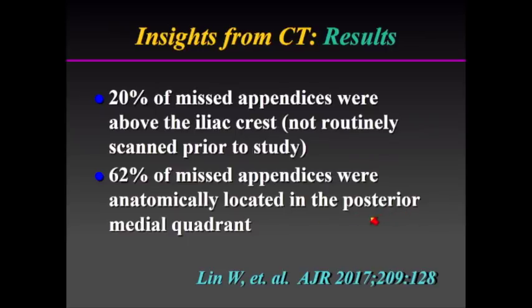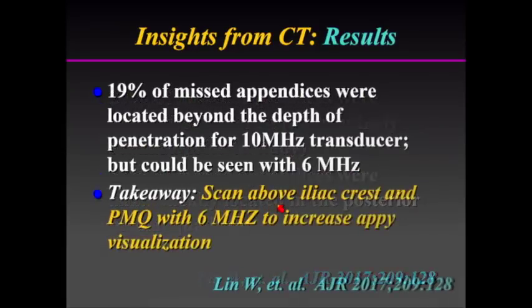Posterior medial quadrant. That's really what we do. So after we've done everything, we've done our three-step positioning, we do a dedicated attempt to look above the crest, and then we need to scan in the posterior medial quadrant.